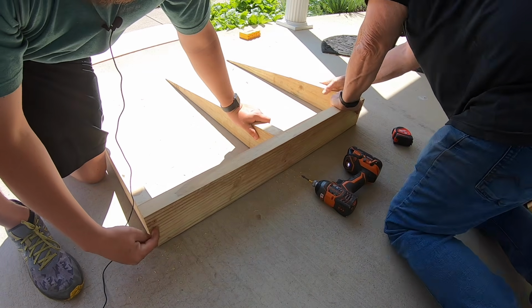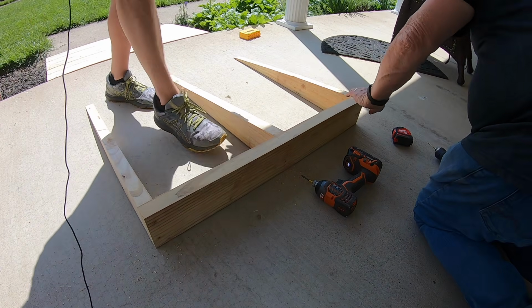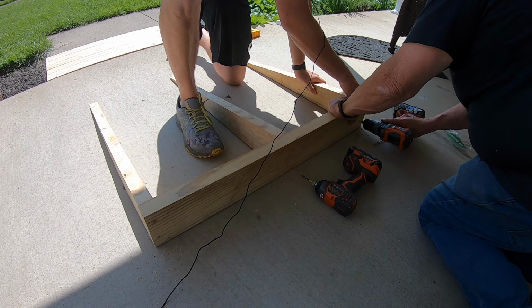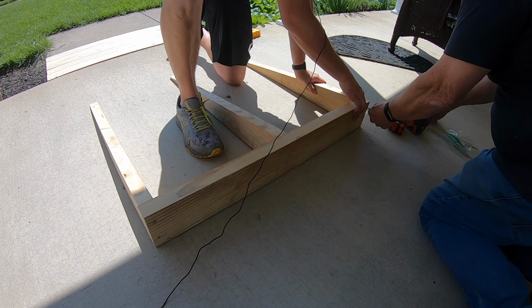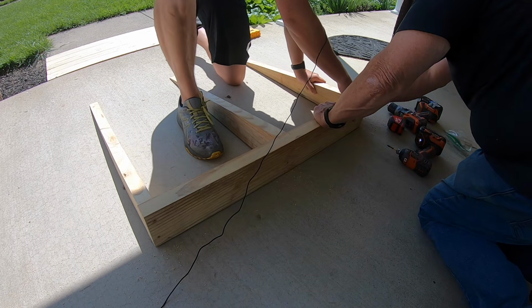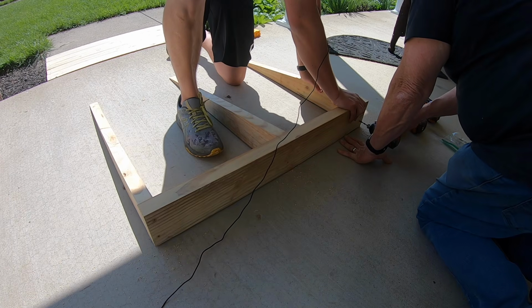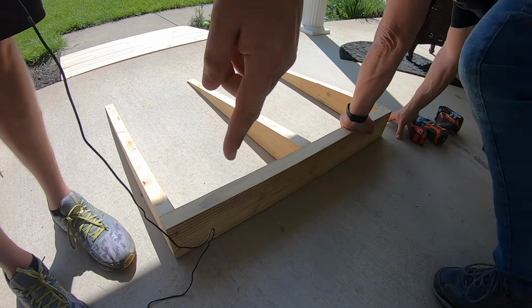And you will want to bury the heads just a little bit. That will help them not rub up against the brick as much. Bottom needs to come in a little. Good. So now that is already done, you got all of them that you need.